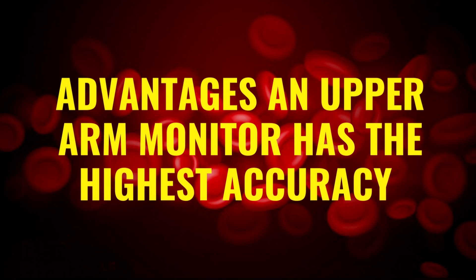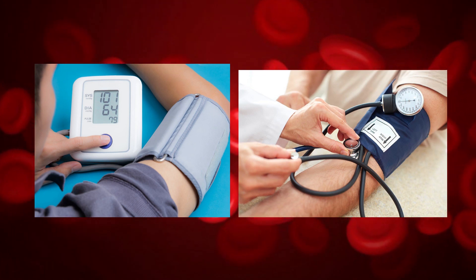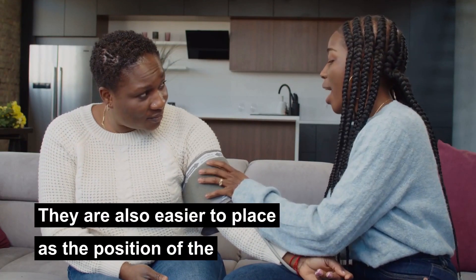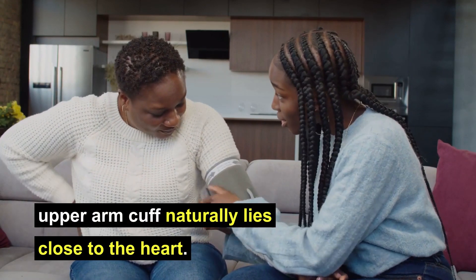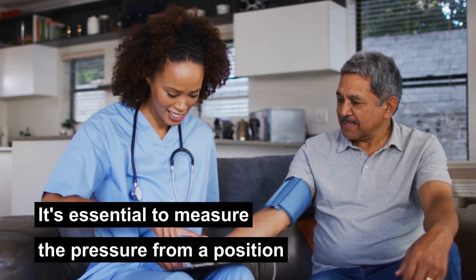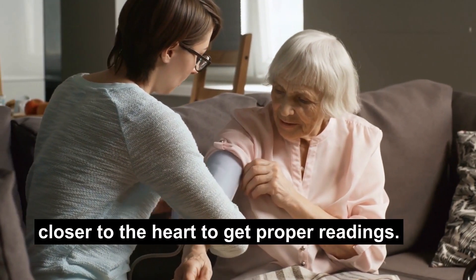Let's talk about the advantages. An upper arm monitor has the highest accuracy, and this is true for both digital and analog monitors. They are also easier to place, as the position of the upper arm cuff naturally lies close to the heart. It's essential to measure the pressure from a position closer to the heart to get proper readings.